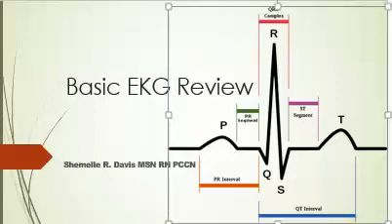Hello, so today we are going to do part one of a 2 video series on EKGs. So today we're going to cover basic anatomy and physiology of the conduction cycle and the cardiac cycle. We're going to talk about wave identification, analyzing rhythms, and rhythm interpretation, okay? And in part two, I'll go on to talk about exactly clinically how the patients look and how we will manage and treat the patients. So let's get started with part one.